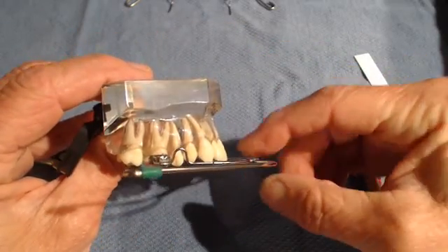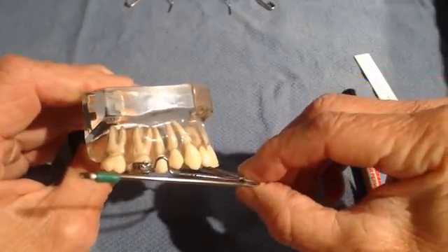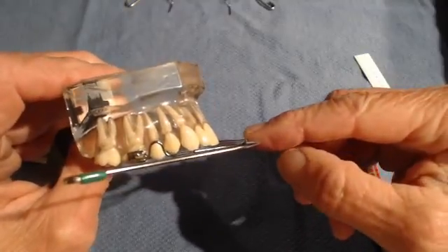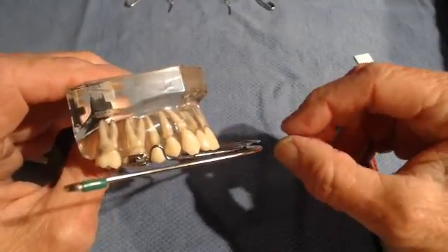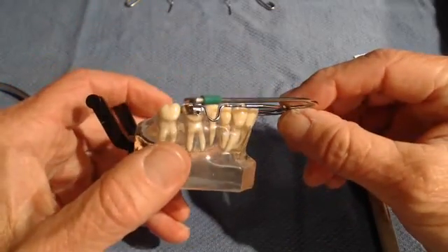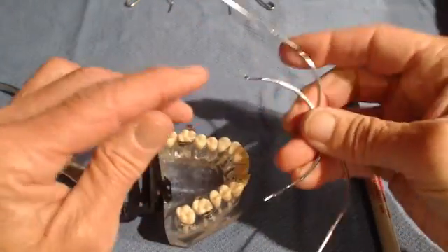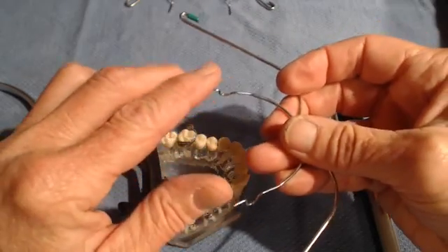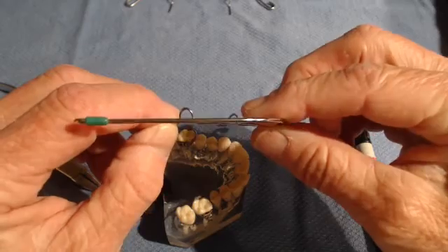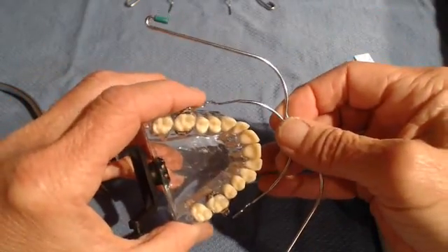Next, consider how the headgear fits the arch — is it sitting up or putting pressure below the lip? You want the outer bow to exit right at the commissure of the lips, and this is important for patient comfort since you expect them to sleep and work in this. You can always adjust that by bending the two ends of the outer bow up or down respectively. Hopefully your instructor will go over that in class related to headgear fitting.